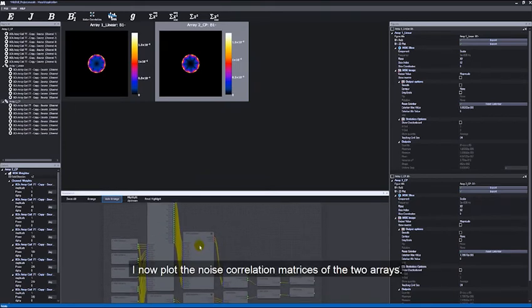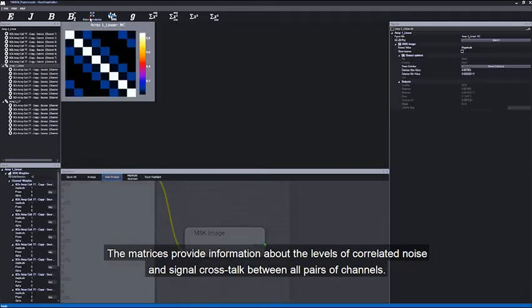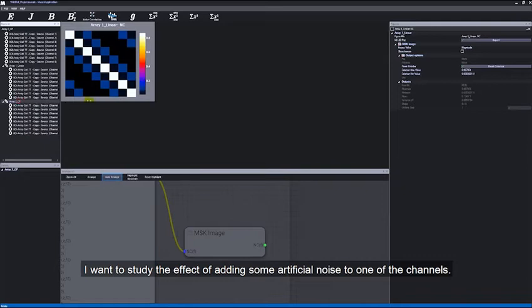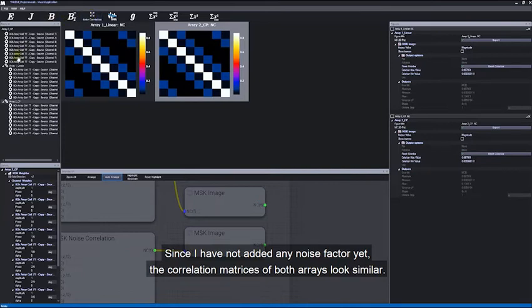I now plot the noise correlation matrices of the two arrays. The matrices provide information about the levels of correlated noise and signal crosstalk between all pairs of channels. I want to study the effect of adding some artificial noise to one of the channels. Since I've not added any noise factor yet, the correlation matrices of both arrays look similar.